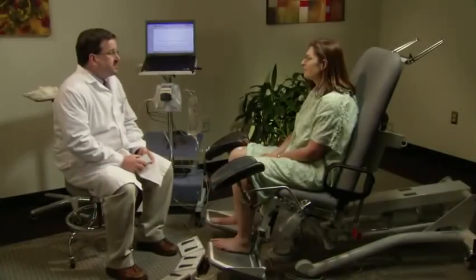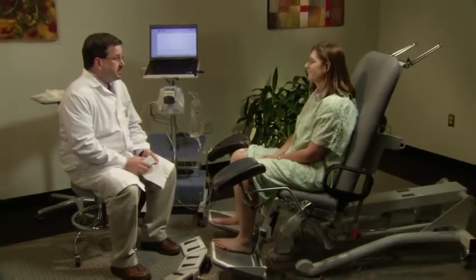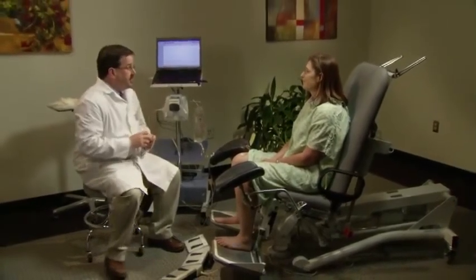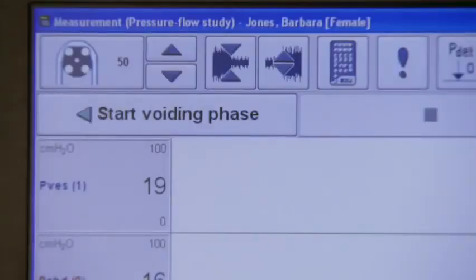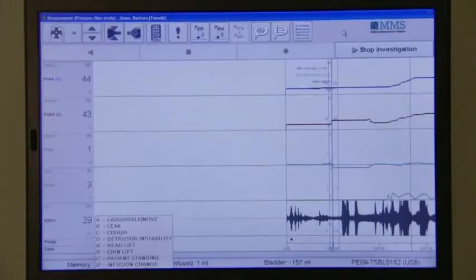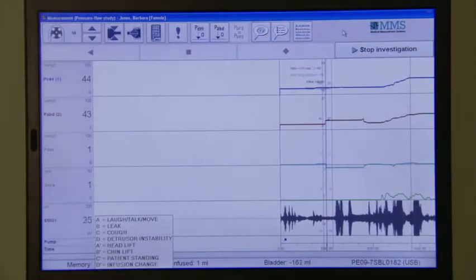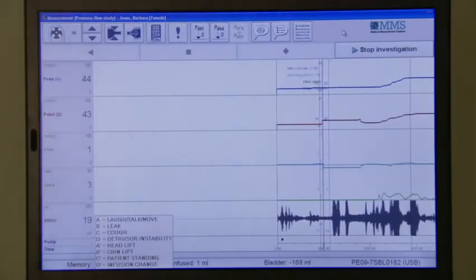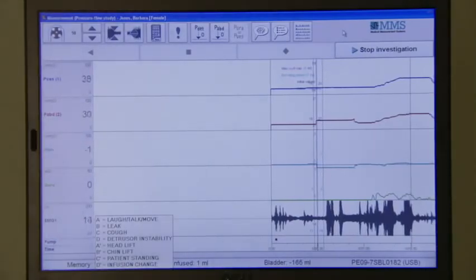The nurse tells Mrs. Jones that the filling phase is complete and it is now time for the voiding phase. The patient is asked to empty her bladder as naturally as possible. The second part of the pressure flow study analyzes voiding function to determine if failure to empty is due to outlet obstruction, decreased bladder contractility, or both. During this phase, the catheters and EMG leads all remain in place while the patient voids.